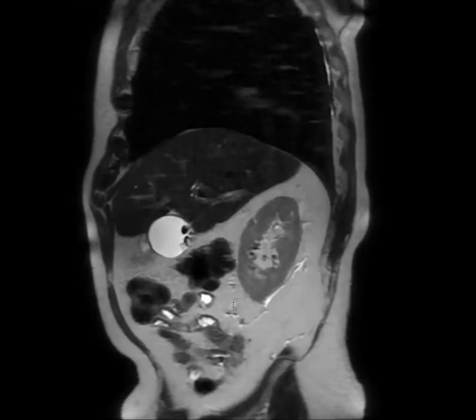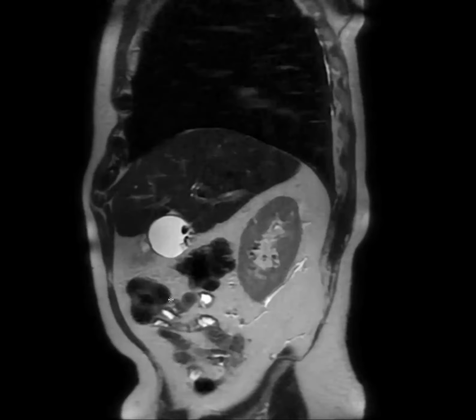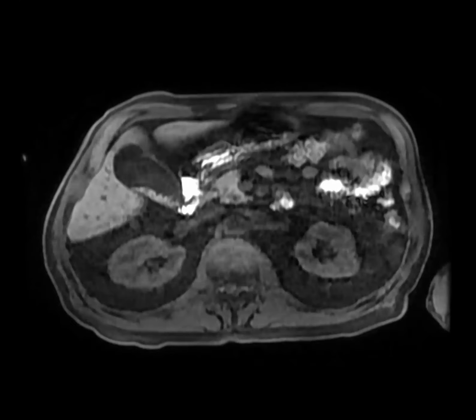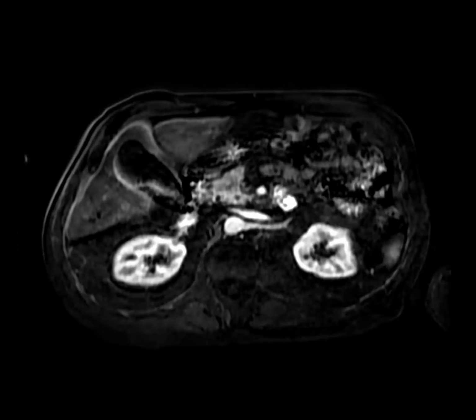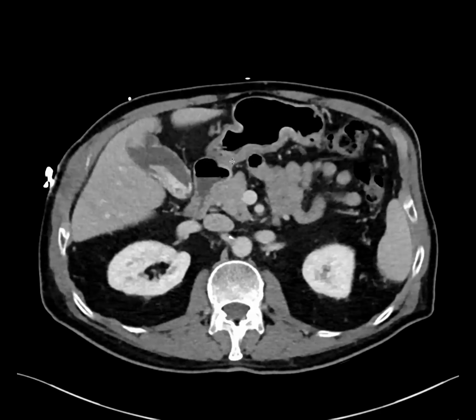There's like a phrygian cap that's folded over or something. Right there. Then it's like sludge inside. Yes, and that linear thing wasn't enhancing either. It's just tumefactive sludge or something. Or a stone. On the T2, it looked like a long T2 dark thing, very dark. Isn't it like a plate-like stone? Yeah. Perhaps, yeah. Cast maybe. Yeah, right there.